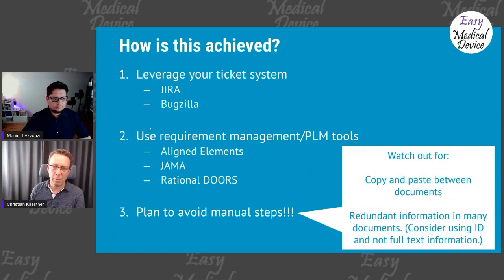In many cases it's there probably for traceability purposes, but then you could consider, as I suggest down in the corner, just using the ID, as I said before, SYS dash a number, instead of the full text. Then you still have the traceability and linkage between them.